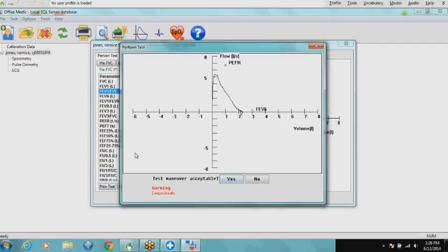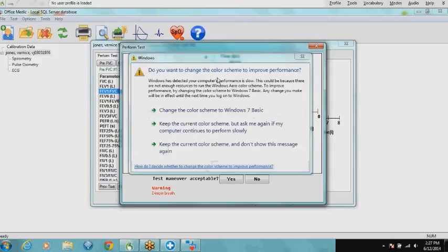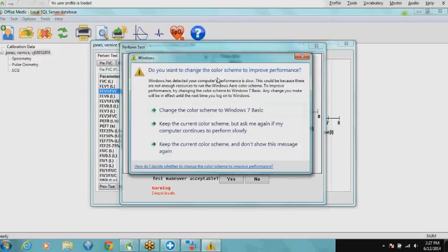And it says that it's trying to coach us to perform to our predicted value. Now, if you're not feeling a little lightheaded and perhaps a little dizzy, a little red in the face, so to speak, and maybe even a little silly, then you're not performing this test to your maximal effort. Oh, she said she's not. So we need to have her do it again. That's okay.